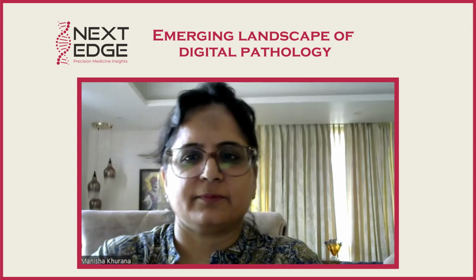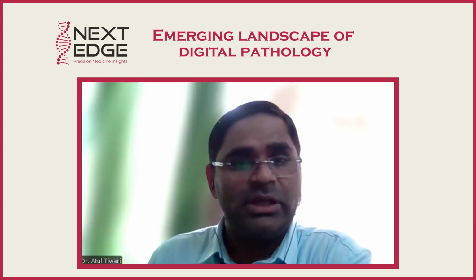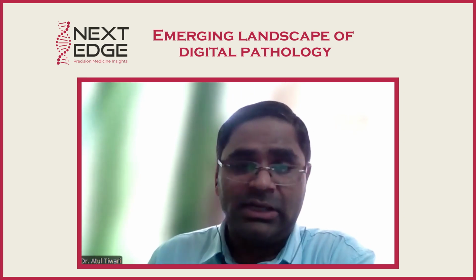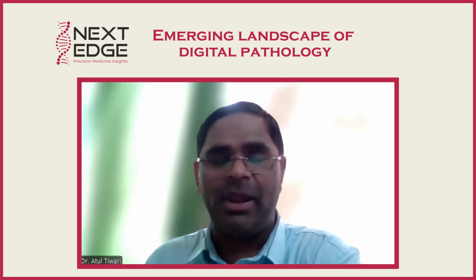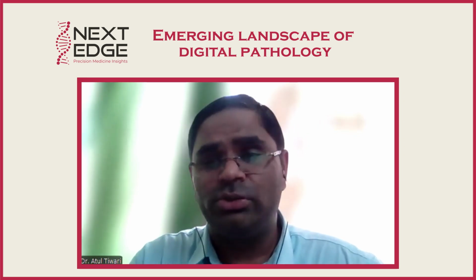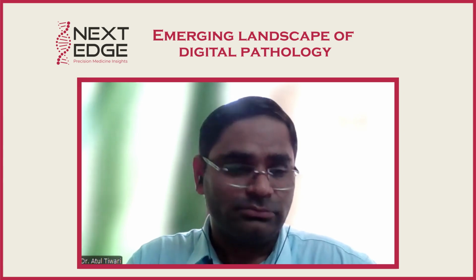So, how accurate and reliable is digital pathology interpretation for precise diagnosis? Digital pathology has proven high accuracy and reliability for precision diagnosis. But there are certain conditions that apply. The conditions are that the image is of high resolution.